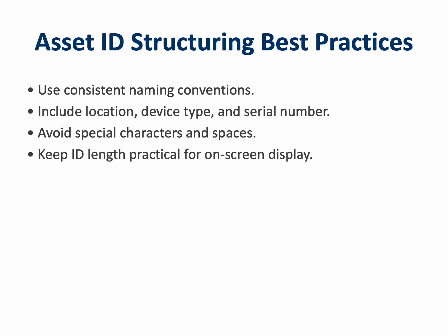ICU-INFUS-0342. Avoid special characters as they can cause compatibility issues during data exports. Keep the total length short enough to display clearly on screen and printed reports. Once a naming convention is chosen, apply it uniformly across all test equipment and software systems. This ensures seamless integration between the Rigel analyzer, MedDeviceEngineerX, and your facility's asset database.